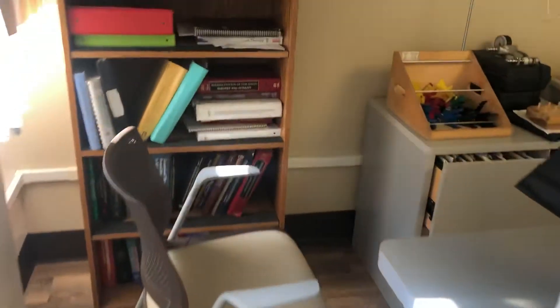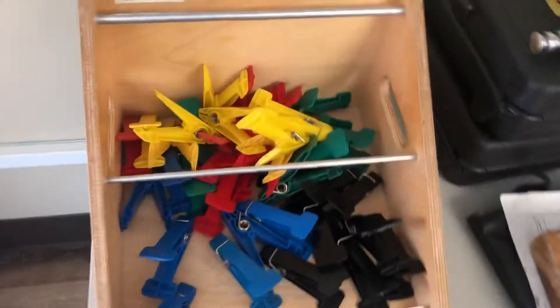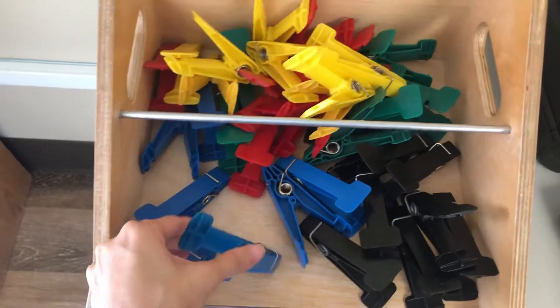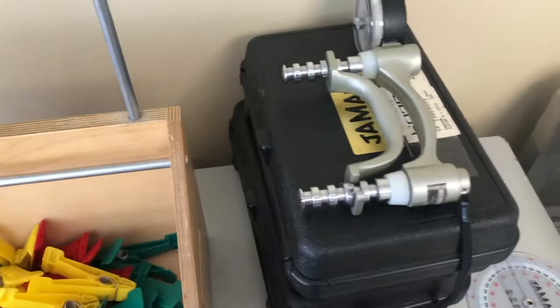If you come over here, we have a bunch of material on hand therapy. This is for grip and pinch as well.